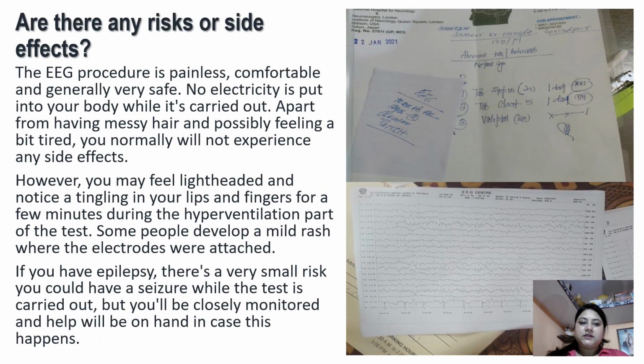Are there any risks or side effects? The EEG procedure is painless, comfortable and generally very safe. No electricity is put into your body while it's carried out. Apart from having messy hair and possibly feeling a bit tired, you normally will not experience any side effects. However, you may feel lightheaded and notice a tingling in your lips and fingers for a few minutes during the hyperventilation part of the test.